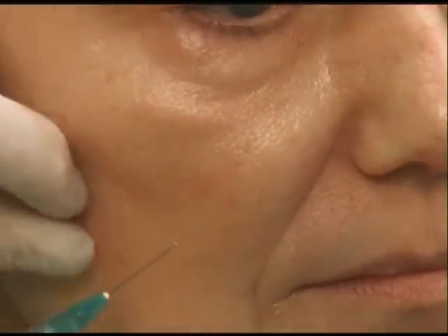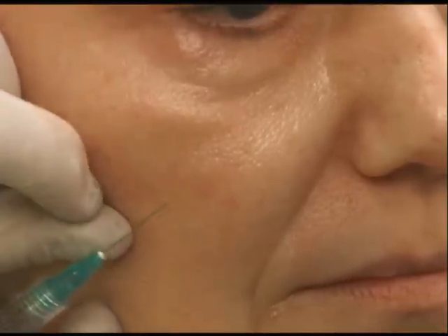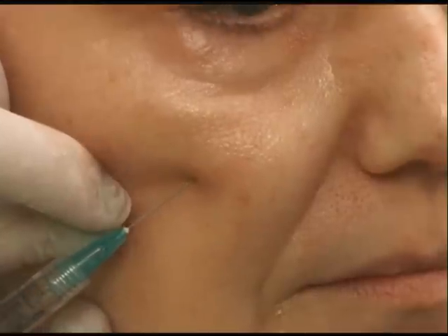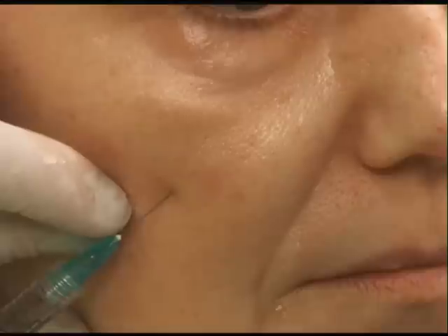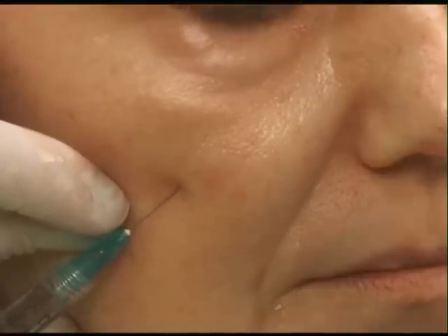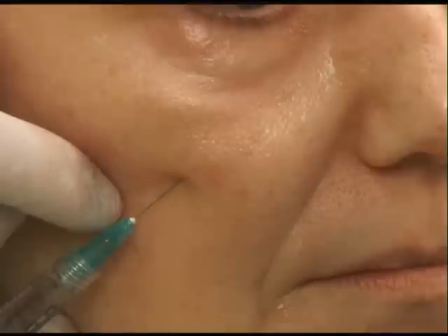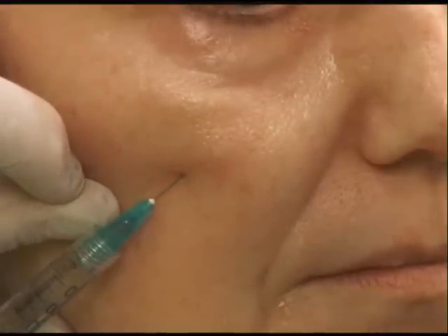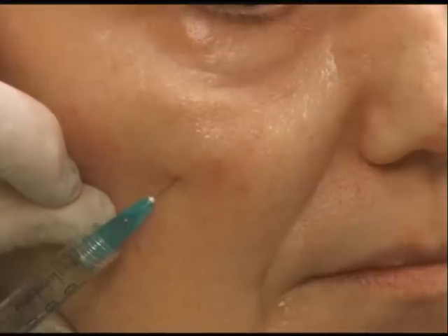I like to try to get under the eye and across the anterior malar area with one puncture if possible. I just advance my needles and use larger needles. Right now I'm using a 28-gauge, 3/4-inch needle, which is a great workhorse for a lot of areas. She has the little malar separation here that we're going to start filling. I'm subdermal — there's no resistance as I advance, and I inject as I go. You can kind of see it fill as I'm going in.